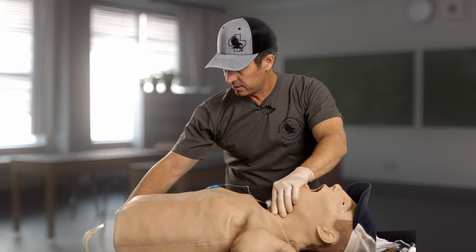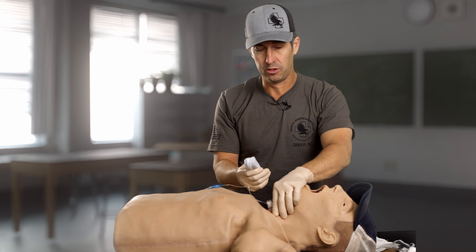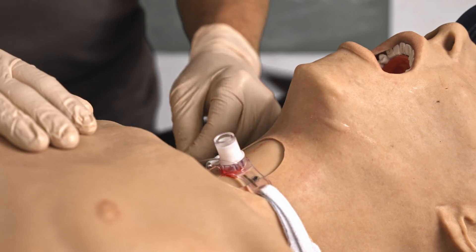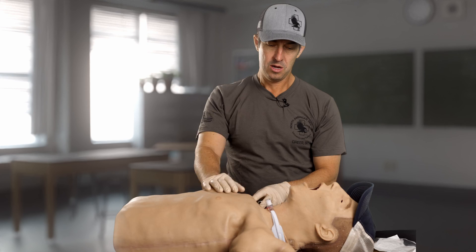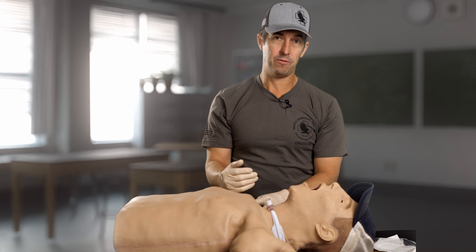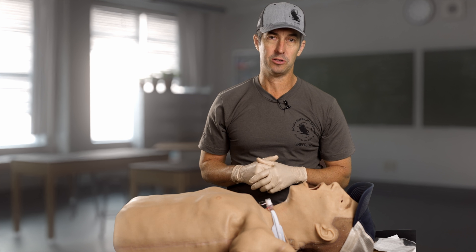Finally, I'm going to take my tracheal tube holder and secure that into place. My cricothyroidotomy is in place, secured, the balloon is inflated, and my casualty is either breathing through that tube or I'm breathing for them. Monitoring and rechecking at all times. Remember, there are multiple ways to do a cricothyroidotomy — follow your medical director's instruction and your local protocols.